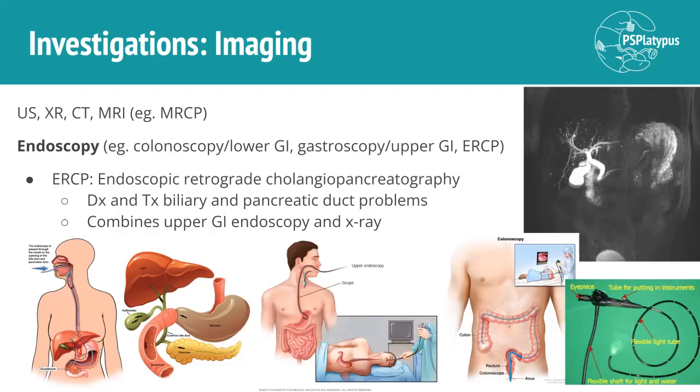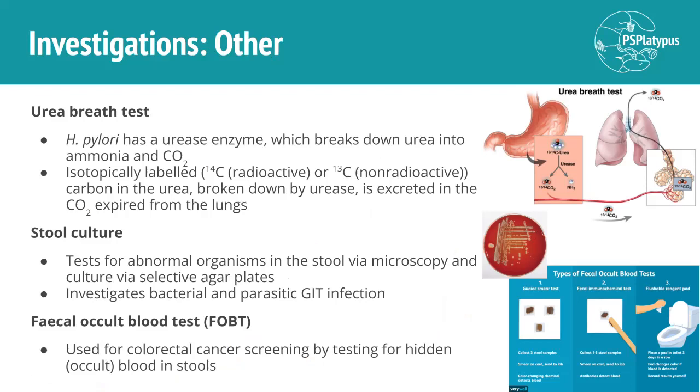So this top right image here you can see in black and white. That's basically an MRI, but we've tuned the density, the radio density, so we're looking at that of bile. And so we can actually visualize with pretty nice quality the biliary tree and see if there's any obstructions, anything like that. This really is just a very brief summary, also because I don't know a great amount about it, but yeah, there you are.